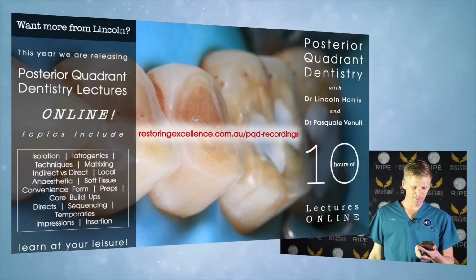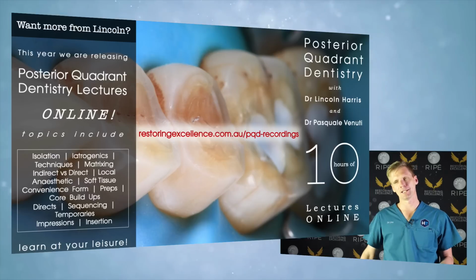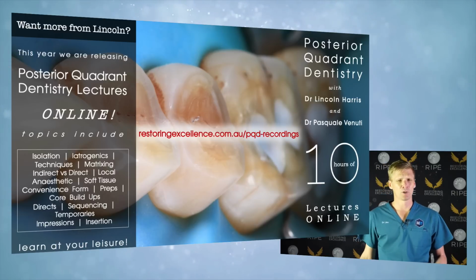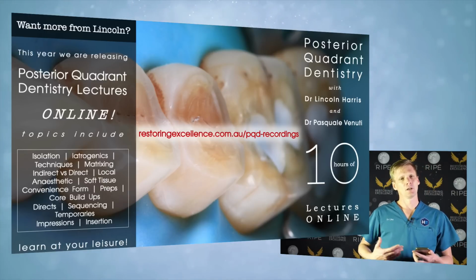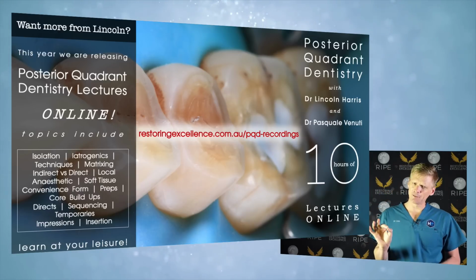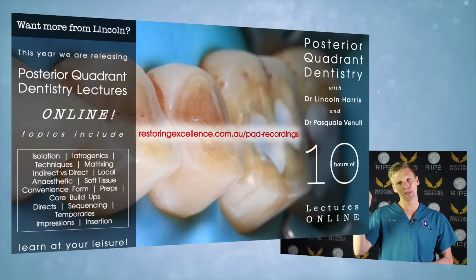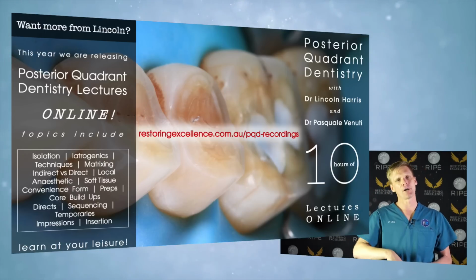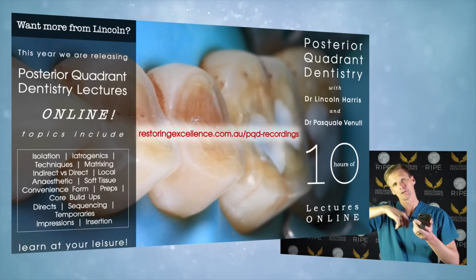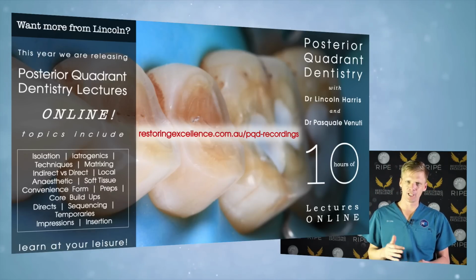Okay, it's from Zaid. So how much viscostat can be used without causing recession? It doesn't actually matter how much you use, it matters how long you use it. So if you use it in thin tissue and you leave it in there for more than 10 minutes, then you may cause recession. So thin tissue is difficult. If recession is a huge risk for you, do a soft tissue graft beforehand, okay? Because sometimes when you have thin tissue, the tissue itself retracts quite easily just by doing hardly anything. So when you have really thin tissue, often where you need the retraction is on the mesial, distal and the lingual and none on the buccal. So those cases, instead of putting the cord all the way around, you would just start on the distal, go around the lingual and to the mesial and not do a full circle with the tail like I normally do. So that's how you can avoid recession if the tissue is really thin.